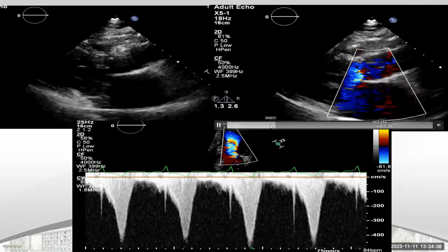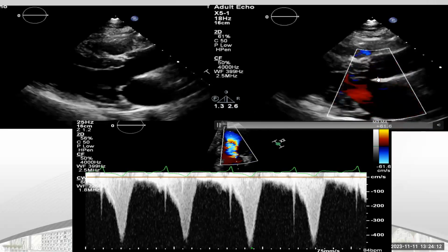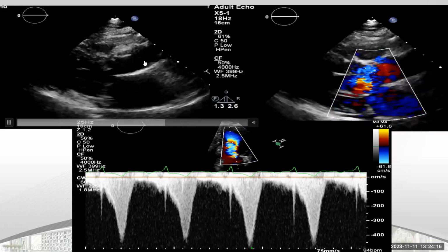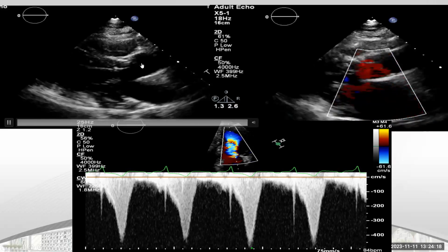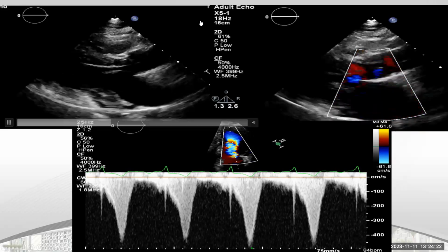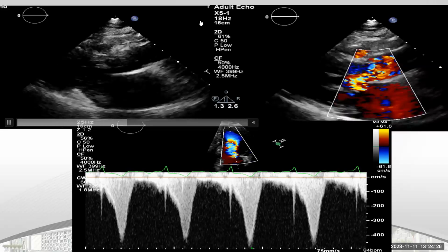However, by color, we can appreciate very easily that we have systolic acceleration flow across the LVOT. It's not across the aortic valve. Especially, aortic valve motion here is normal, or opening is normal. And what do you observe here in the CW? What do we call this sign? Somebody wrote aortic stenosis type. Oh yeah, this is dagger shape. This dagger shape. So if you write aortic stenosis, this is not correct.